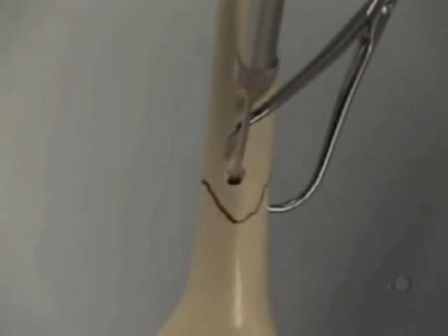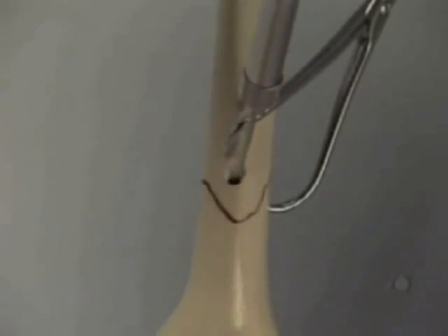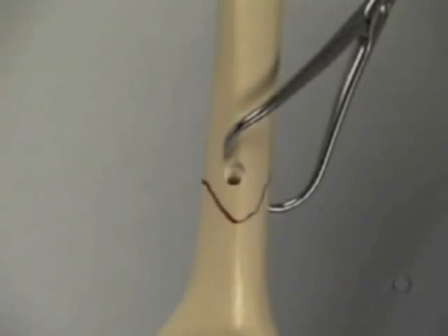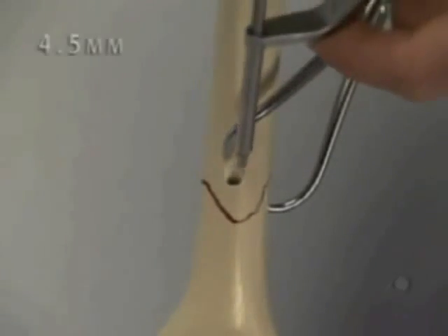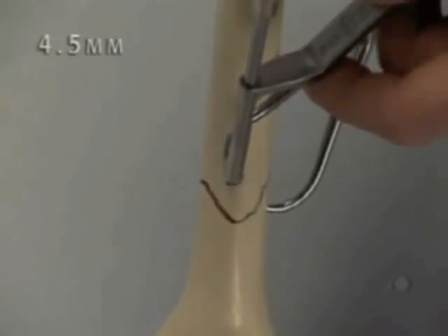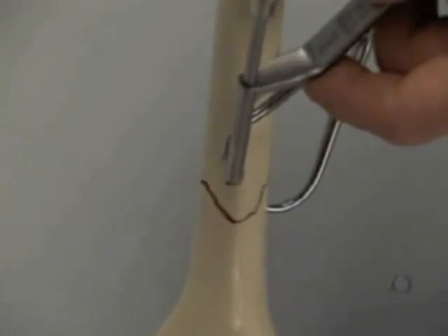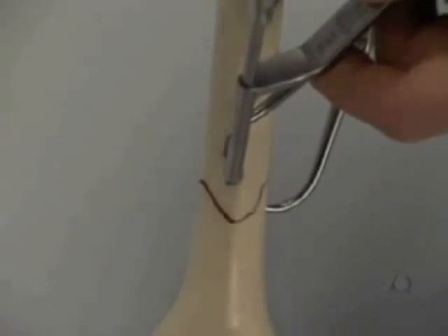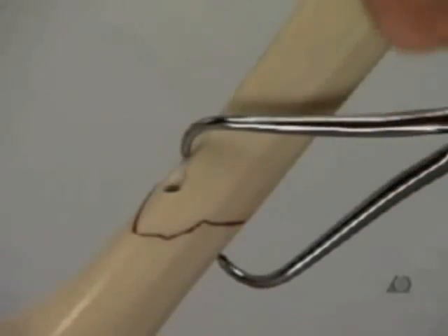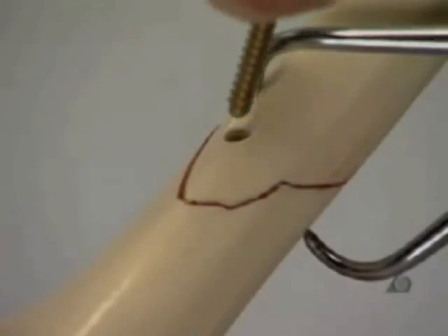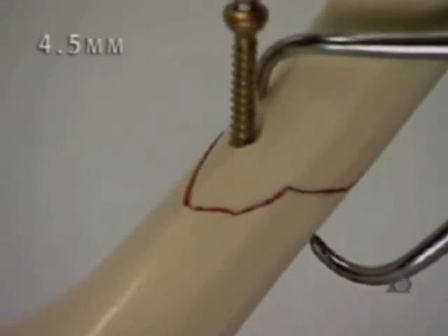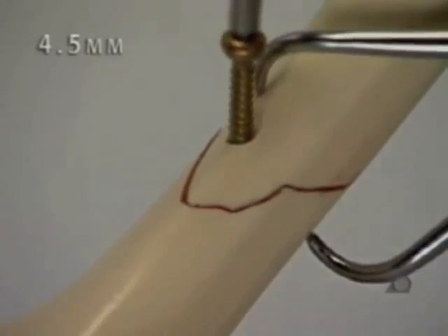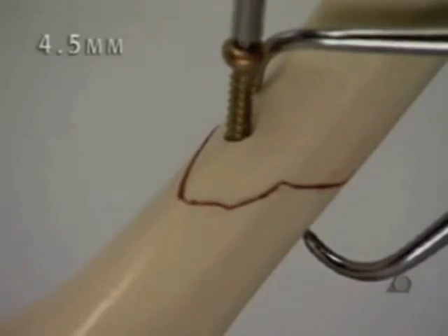The screw length is measured with the depth gauge and the far cortex is tapped. A 4.5 millimeter cortex screw is inserted to provide interfragmentary compression.